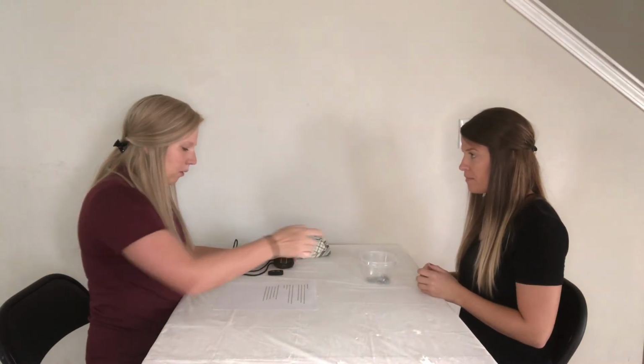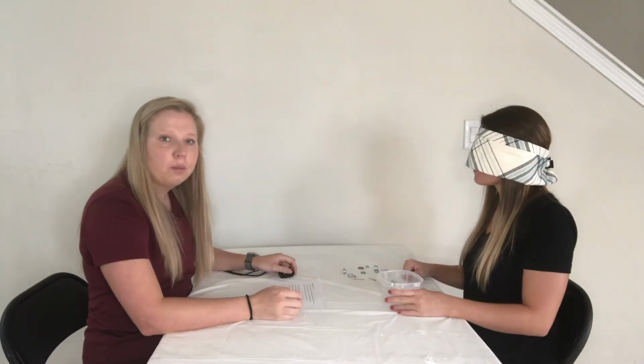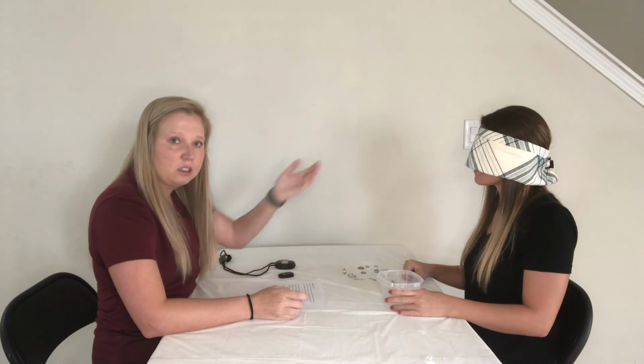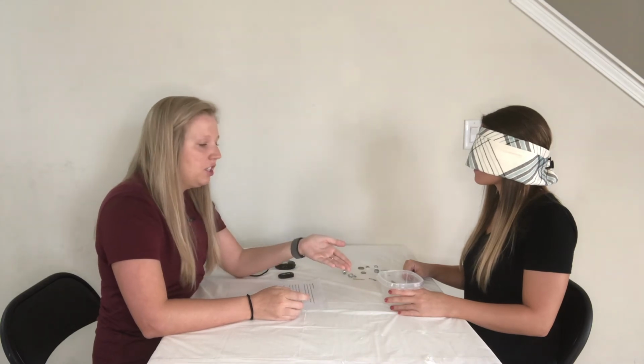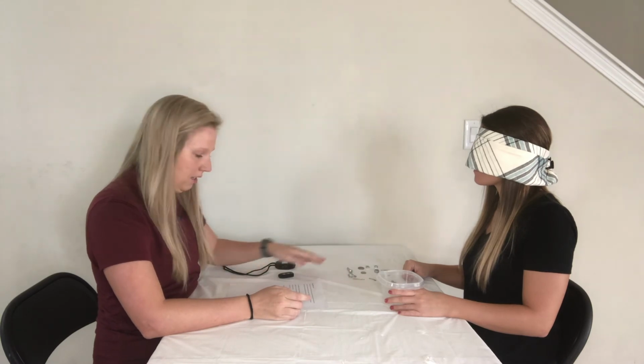Great. Now we will be doing the part of the test where you will be blindfolded. For the portion of the Moberg pickup test where the subject is blindfolded, you can see she is holding the container with her left hand and is picking up the items with her right hand.